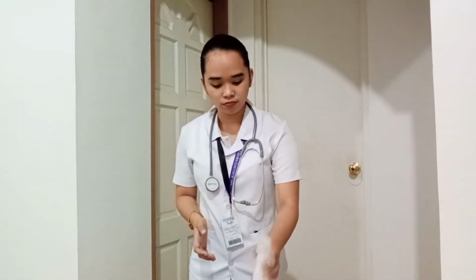Okay, so for checking, there are no problems with my equipment, like there are no leaks between the tubing and the sphygmomanometer. And also, I have the right size of cuff. Before we start the assessment, we need to ensure the privacy of our patient by closing any doors or windows, provide adequate lighting, and provide comfort by adjusting room temperature. We also need to introduce ourselves, verify the client using 2 identifiers, and perform hand hygiene.